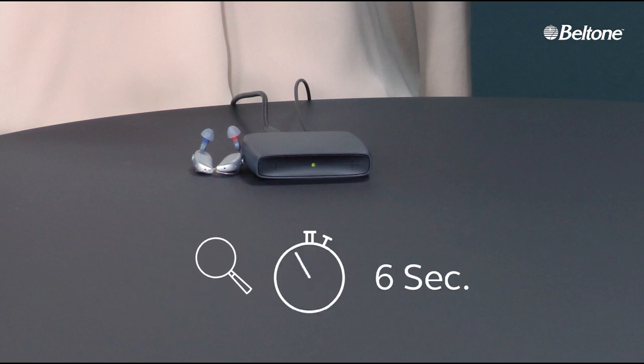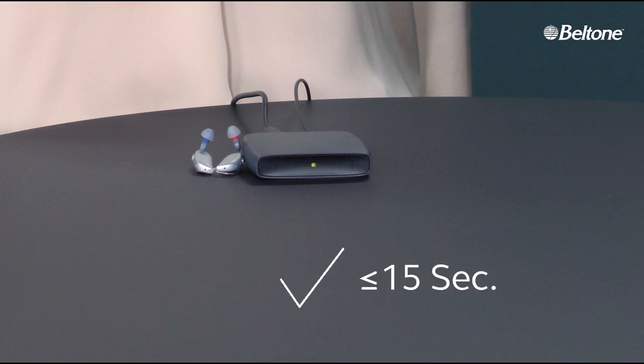The final set of graphics shows a moving magnifying lens and a stopwatch counting the seconds while the device's light continues to blink. Once the stopwatch reaches 15 seconds, the blinking stops and a checkmark icon appears. A final large green checkmark icon is shown. Beltone logo. © 2023 GN Hearing AS. All rights reserved. Beltone is a trademark of GN Hearing AS.